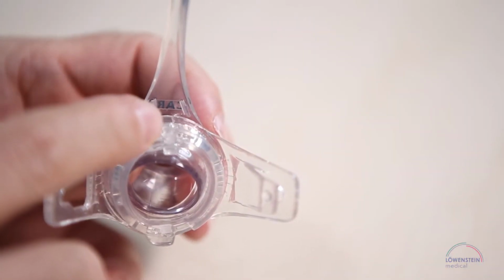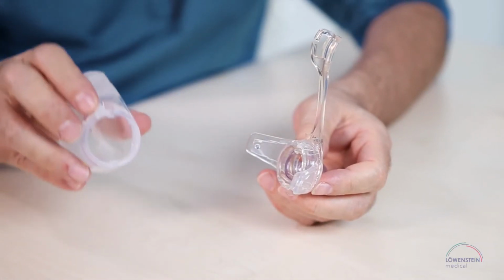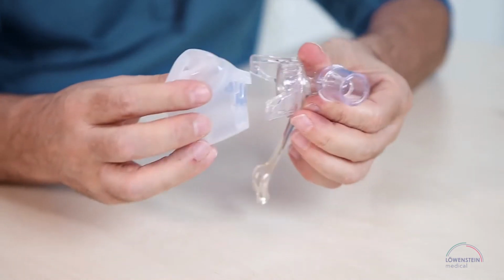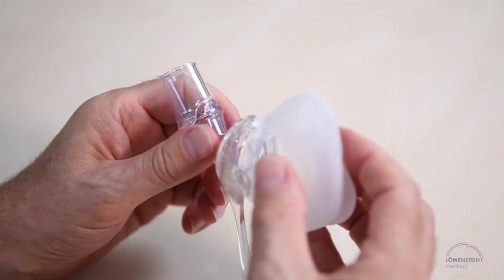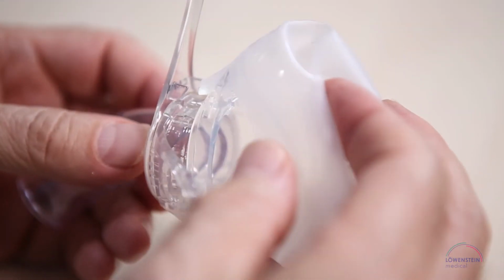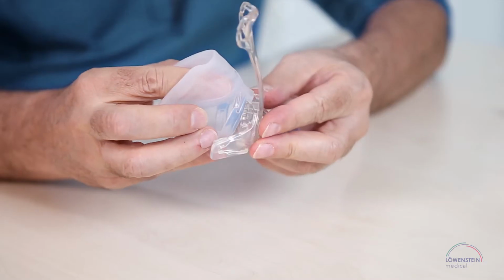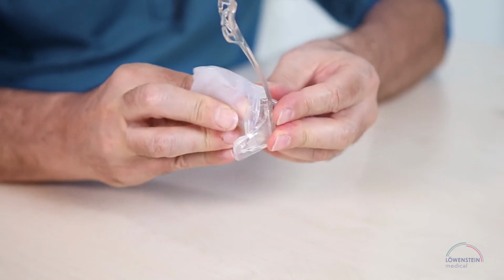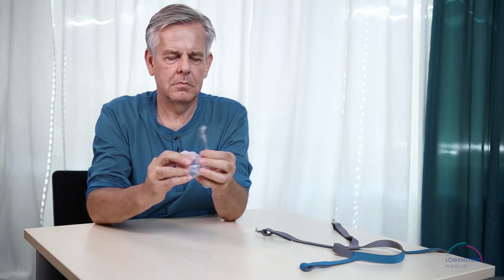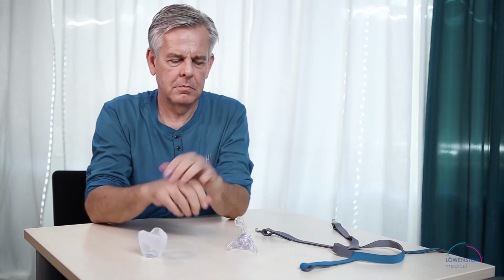A cone-shaped socket on the forehead support helps you to identify quickly the top and bottom of the mask cushion. It will accept only the counterpart on the cushion, so it's impossible to assemble the mask incorrectly. Insert the counterpart into the conical part and press the mask cushion onto the mask frame. To remove the cushion, simply pull it backwards.